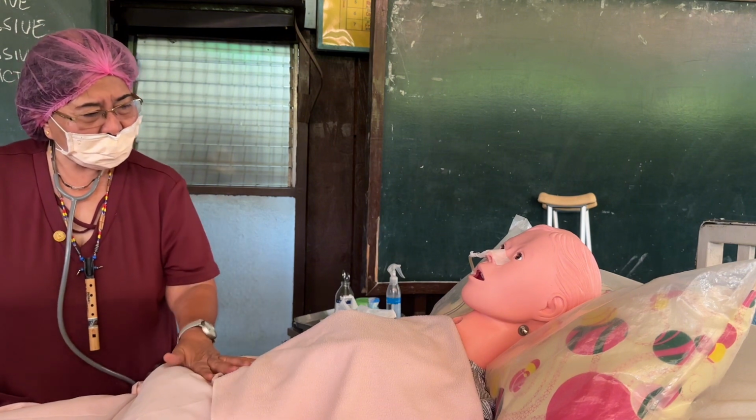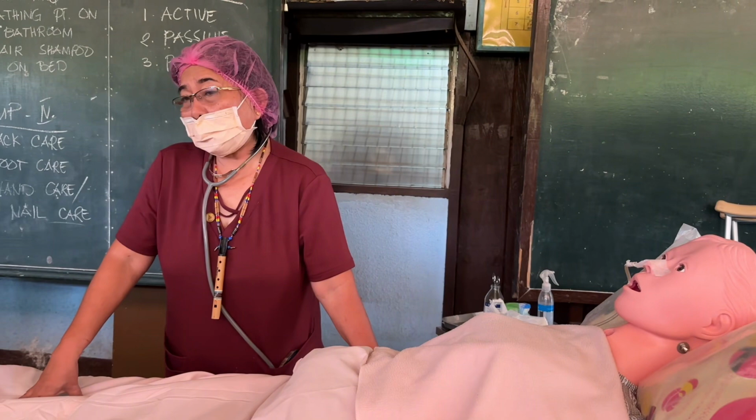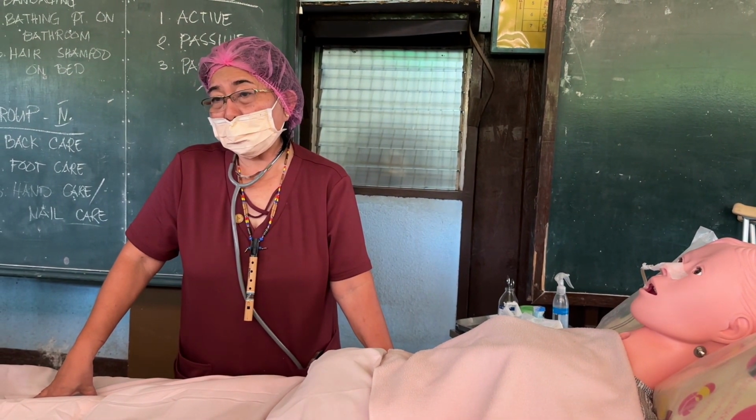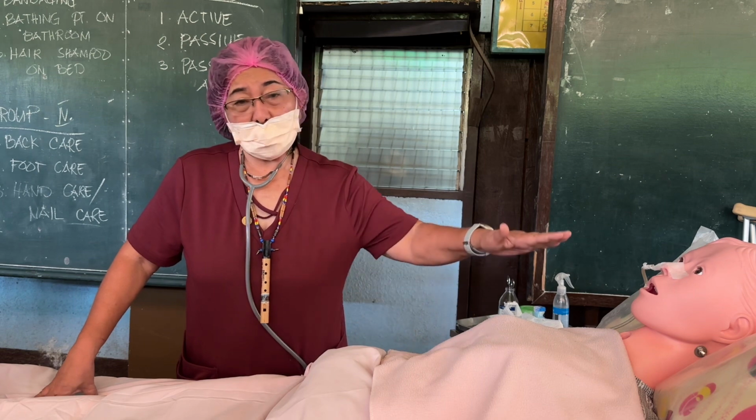Large abdomen, should be drained. What if it does not drain? That means you have to flush it first before the gastric content, the abdominal content, will come out from the stomach.